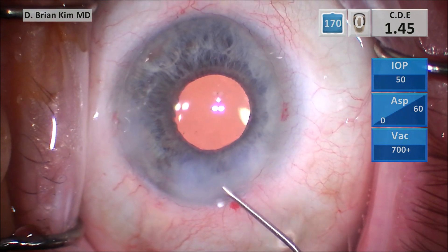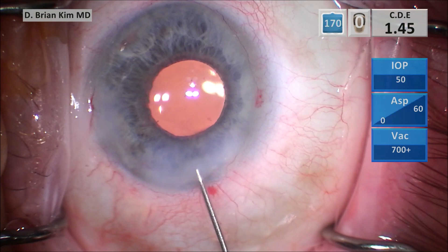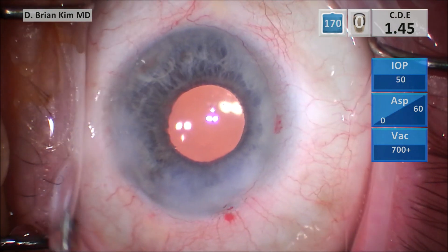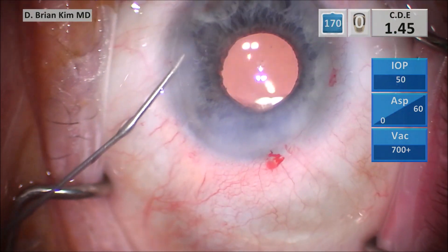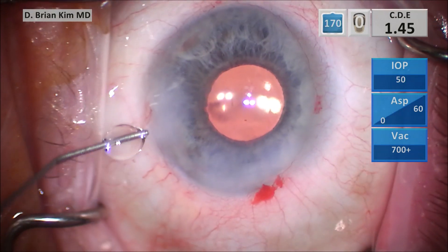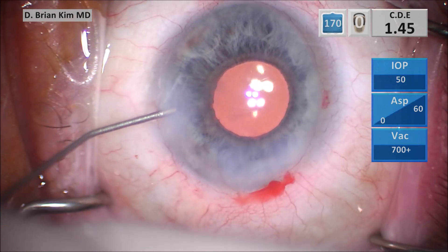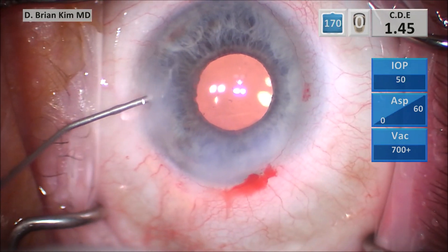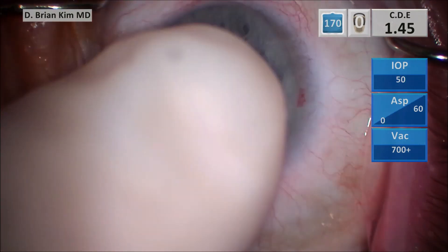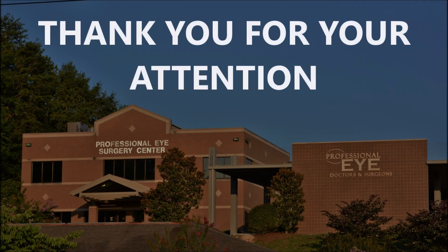It's an average lens density, but you can see this was no problem. I was able to perform double chop, cross chop, and mechanical fracturing techniques — crushing the lens piece within the bag, pulling lens pieces up out of the bag, maintaining the phaco tip in the central safe zone. This is really a very routine case. I don't need Trypan Blue, I don't need hooks, I don't need rings. This technique is, in my opinion, the most versatile way to perform cataract surgery. You're not dependent upon direct visualization or high vacuum. You use mechanical fracturing, which is a very safe way to do cataract surgery. I hope this was helpful. Thank you for your attention.